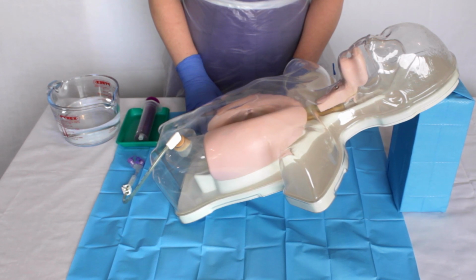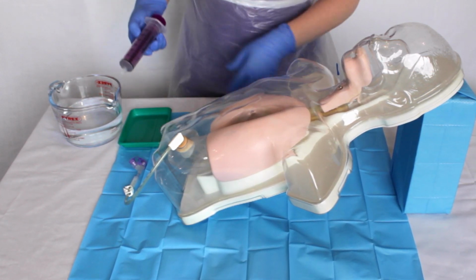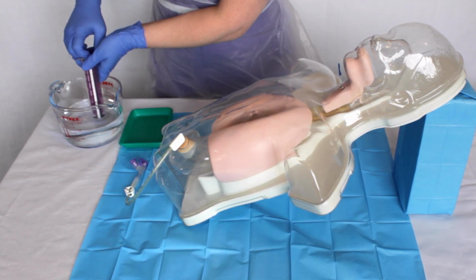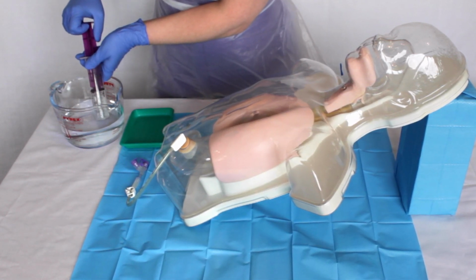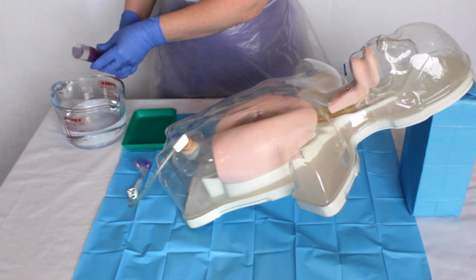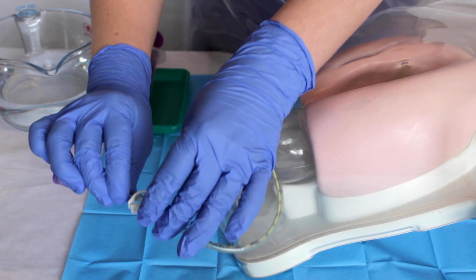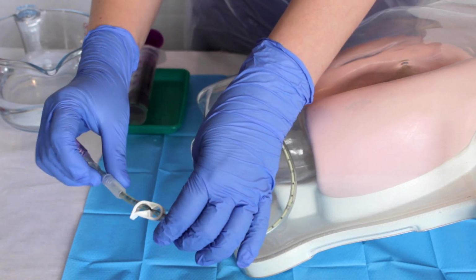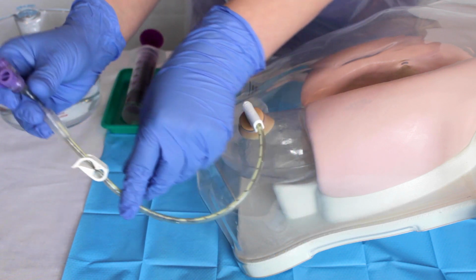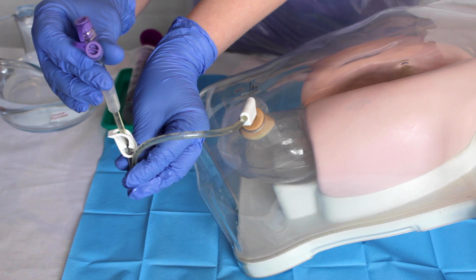In order to administer a water flush using the plunge method, draw up the required volume of water into a 60 ml enteral feeding syringe. If present, ensure the feeding tube clamp is closed before removing the cap from the tube. If no clamp is present, ensure to kink the feeding tube between your fingers in order to stop leakage.